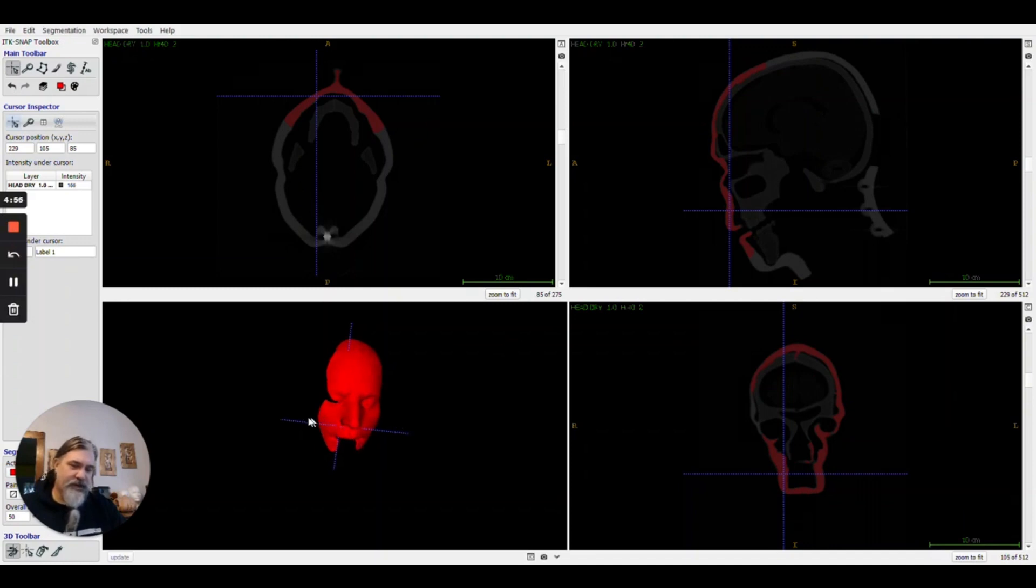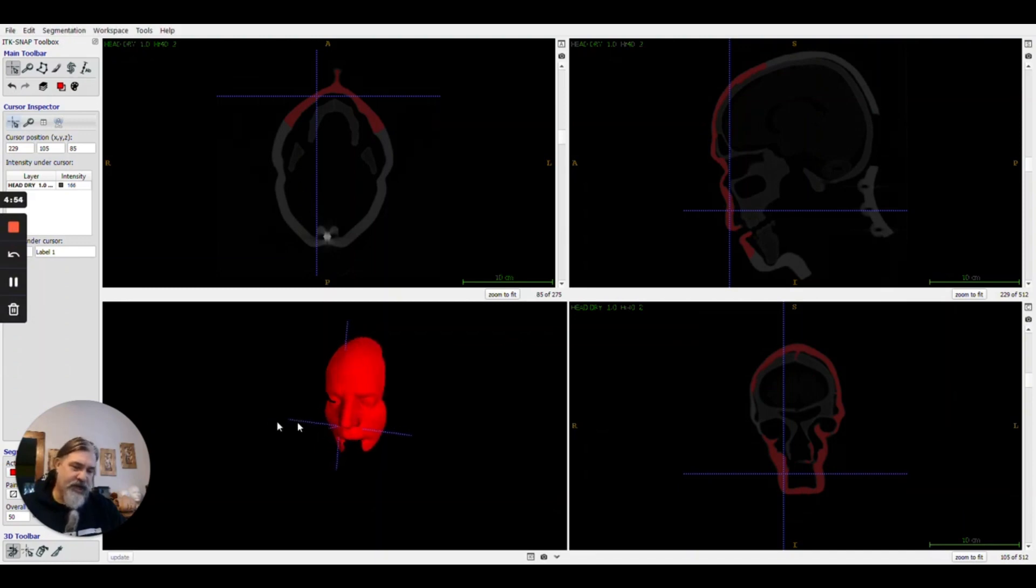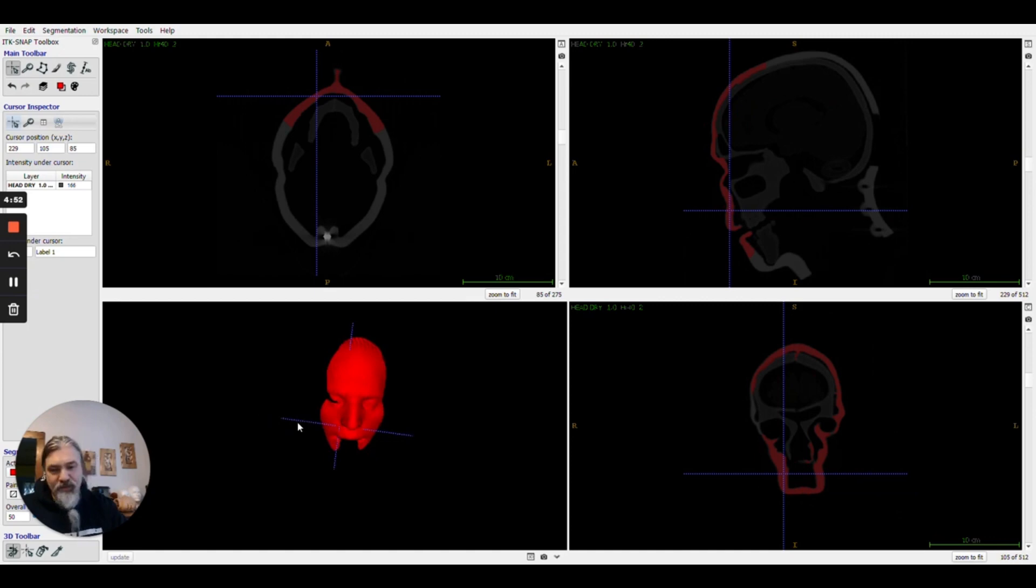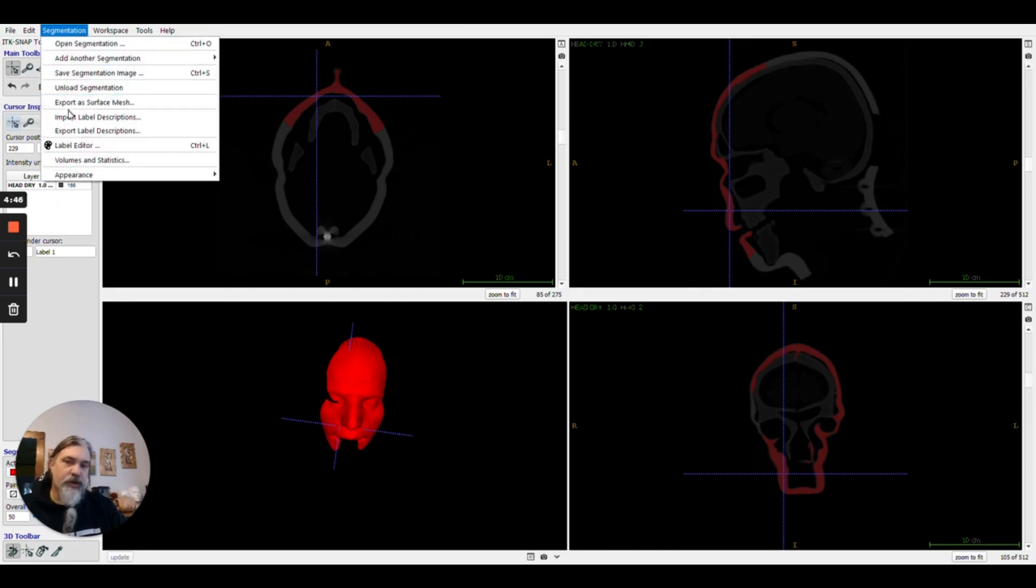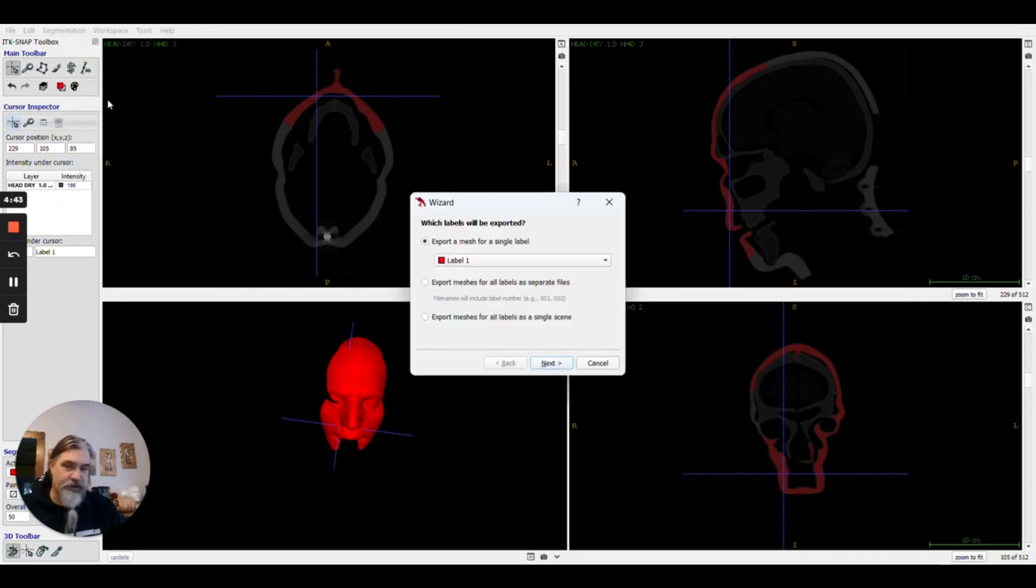We've created an object based on DICOM files and now we want it as a surface mesh. We're going to go up to segmentation, go down to export as surface mesh.